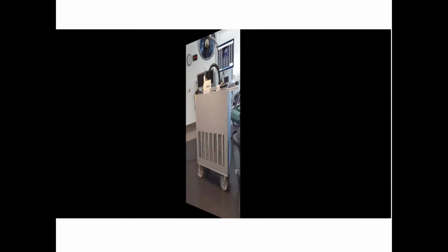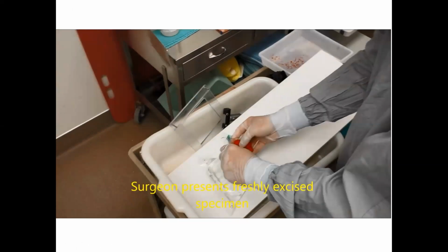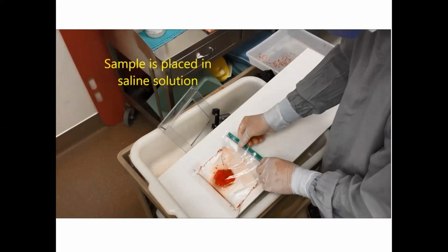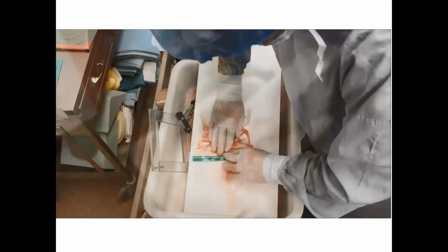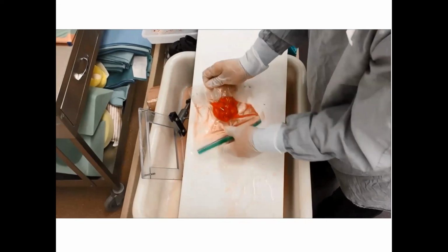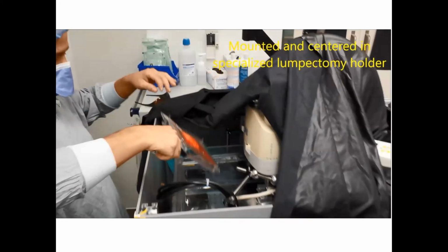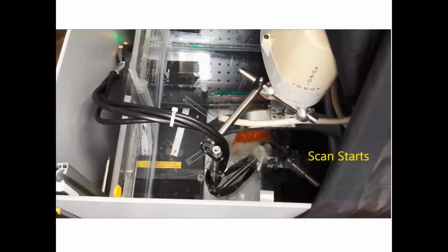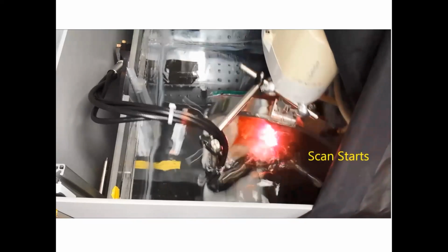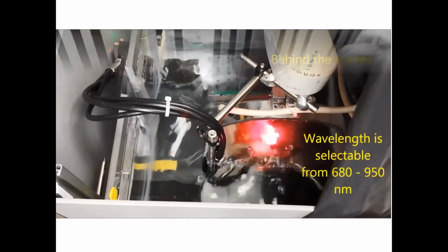Typically, a surgeon presents a freshly excised lumpectomy specimen. The specimen is placed inside a saline-filled Ziploc bag, which is carefully sealed, and bubbles are allowed to escape. This is mounted on a customized lumpectomy specimen holder, which is then inserted into the scanner, and then the scan begins. The system is capable of multispectral illumination ranging from 680 to 950 nanometers for excitation.